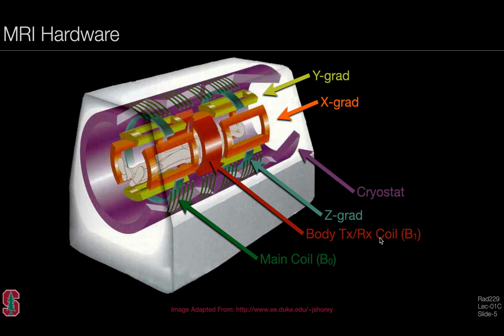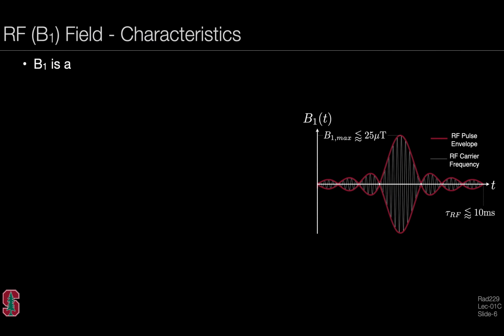It shouldn't be confused with another term, which is sometimes also referred to as a body coil, which is a receiver body coil placed close to the body, much as a head coil or a knee coil or a wrist coil. We sometimes refer to a body coil. But in this specific context, we're talking about the body coil most generally as the transmit coil for generating B1 pulses for excitation.